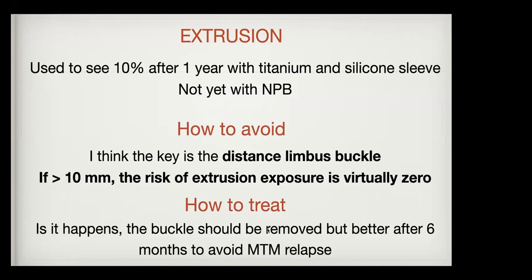Extrusion, I already told you that I used to see extrusion, but now I don't see extrusion. I think that the distance from the limbus is very important to avoid extrusion. And probably also the material that we use might be important. Sponges extrude much more than solid silicone.